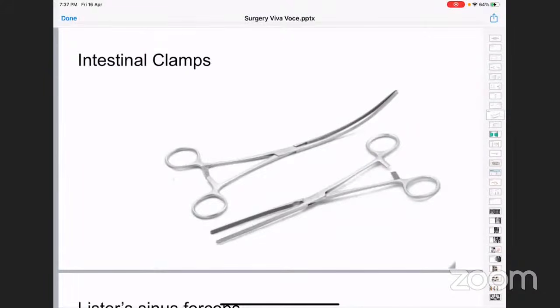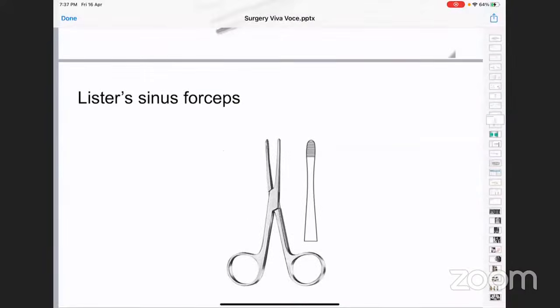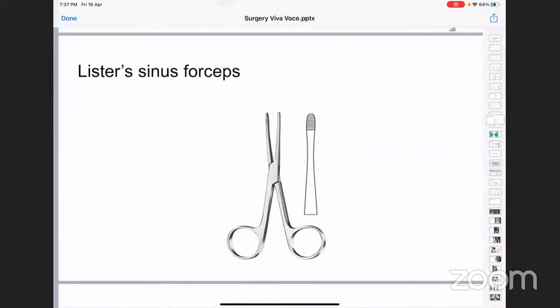Then we also have a system of clamps called the gastrojejunostomy clamps, where you have two interdependent clamp systems, where one side is applied to the stomach and the other side to the jejunum to hold them both in place while you are fashioning a gastrojejunostomy. You can look them up in standard textbooks or online. Most VIVAs usually do not feature these complex instruments. Okay, let us now move on to something quite straightforward.